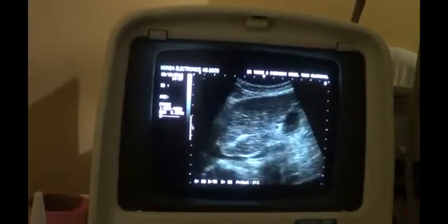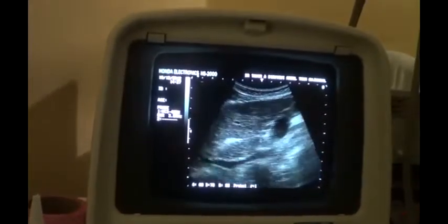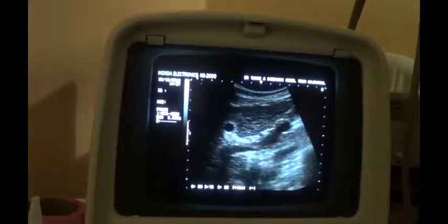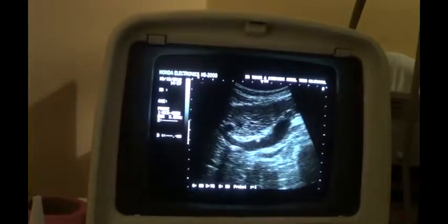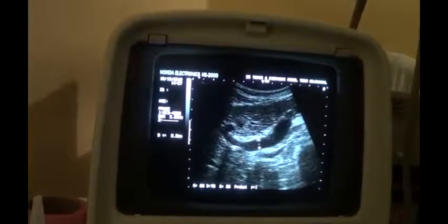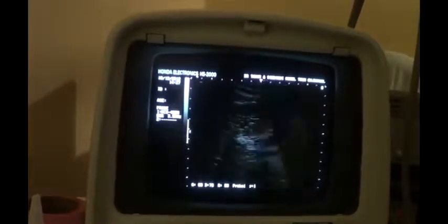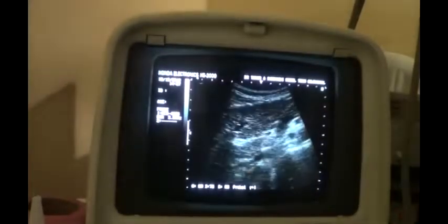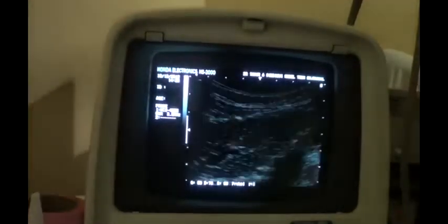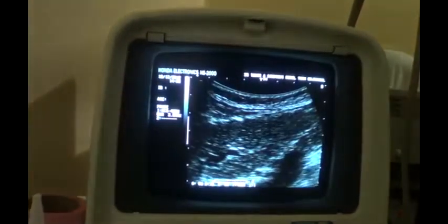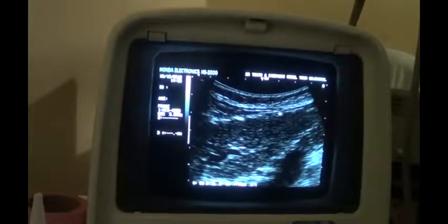So in this case, we see that the caudate lobe is also involved in the cirrhotic process. This is an advanced stage cirrhotic liver with the portal vein measuring from inner to inner about 10.2 millimeters. See the degree of irregularity of the outer surface — this is the outer surface of the liver.